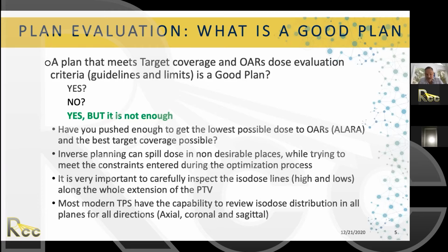Of course, the high isodose is the prescription and the hotspot, but also the low dose. You need to make sure what's happening in the rest of the body, beyond the extension of the PTV.